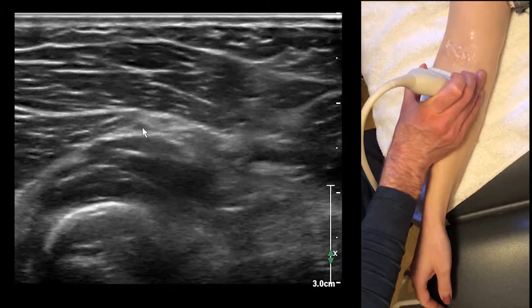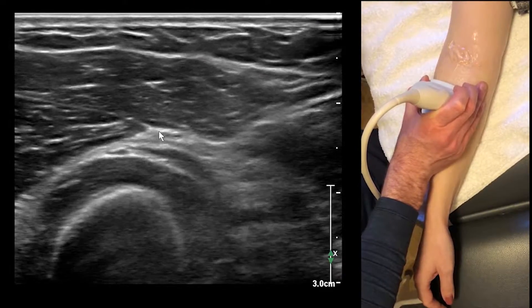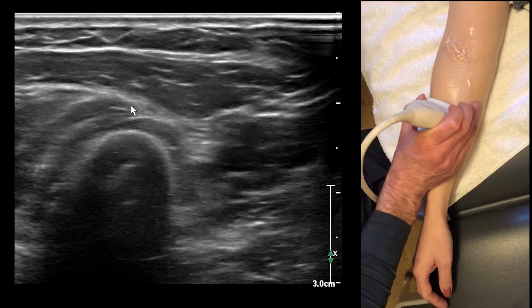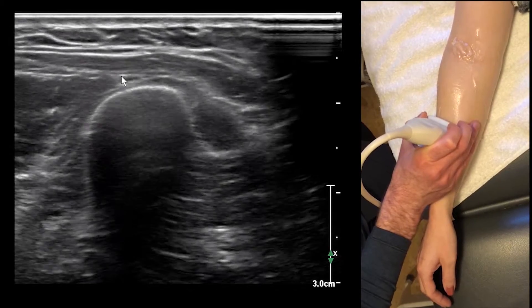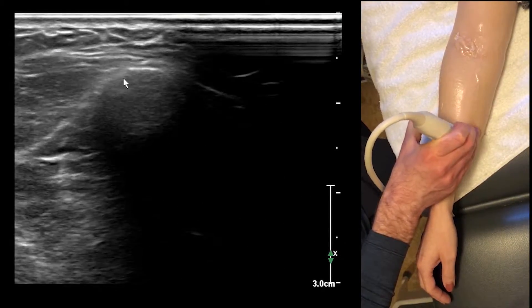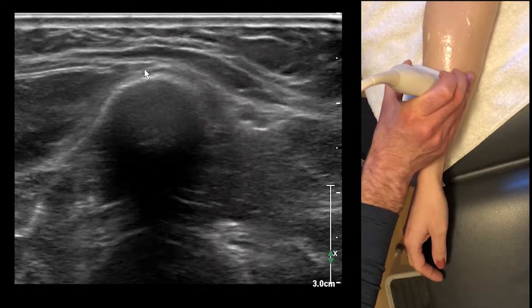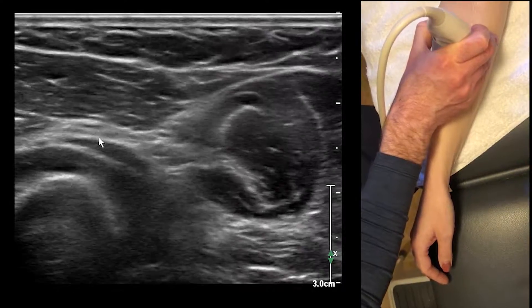We're going to follow it along. This is the deep branch here, this is the superficial branch. Now we're going to follow the superficial branch — it's going to come superficial and travel along the radius, right here. It's really just a monofascicular structure there.